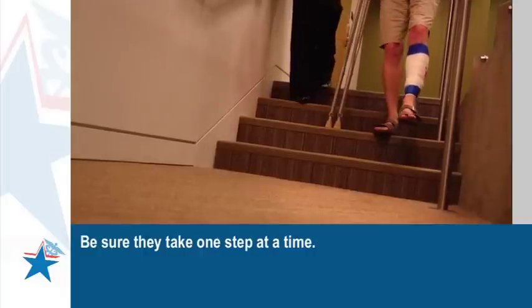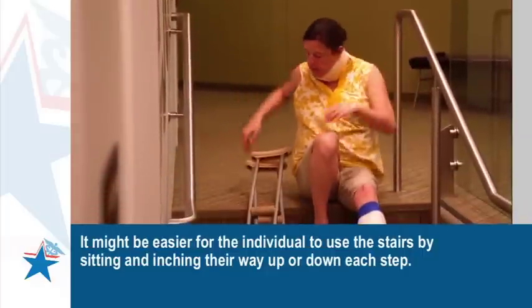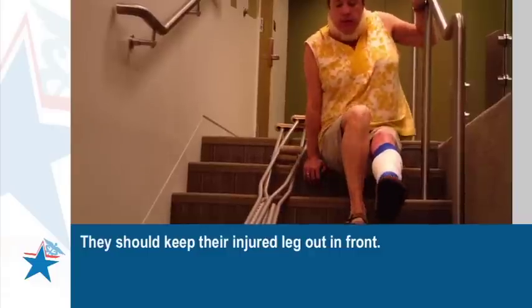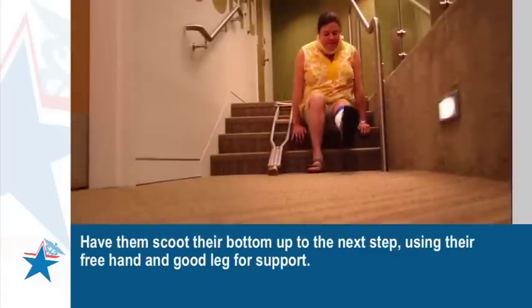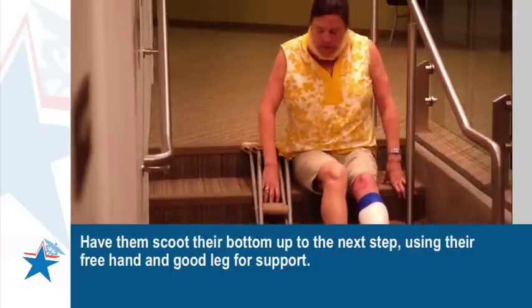Be sure they take one step at a time. It might be easier for the individual to use the stairs by sitting and inching their way up or down each step. They should keep their injured leg out in front. Have them scoot their bottom up to the next step, using their free hand and good leg for support.